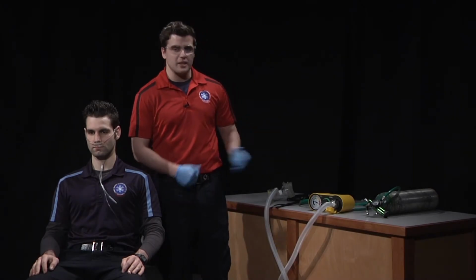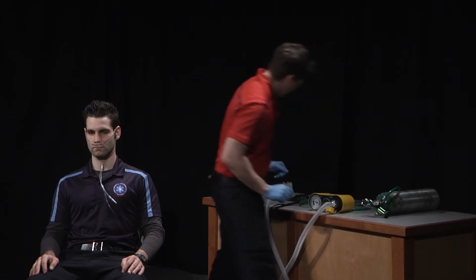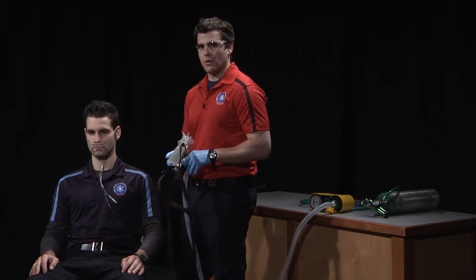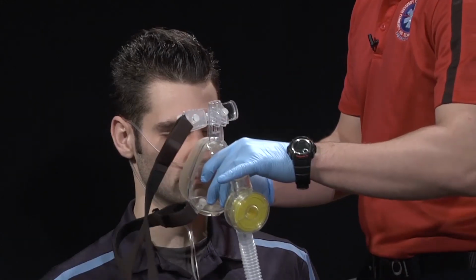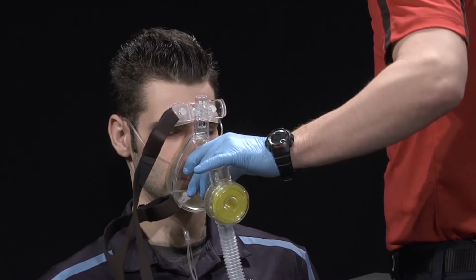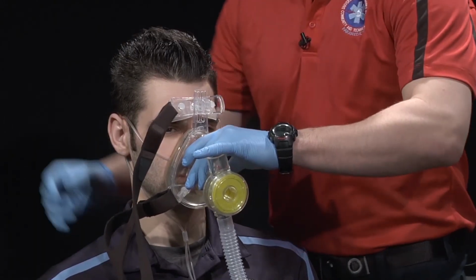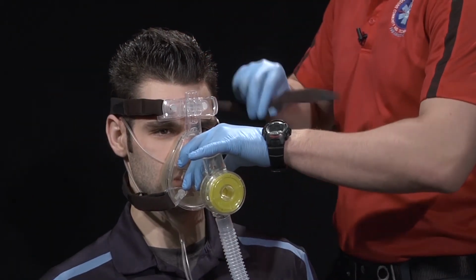After our CPAP machine has been assembled, we're going to go ahead and turn our oxygen on. From there, we're going to take our CPAP mask and we're going to place it over the nose and mouth of the patient while making sure the end-tidal CO2 nasal cannula stays in place. We're then going to titrate our machine to the desired setting and then coach the patient to breathe normally and to adjust to the air pressure while securing the mask.